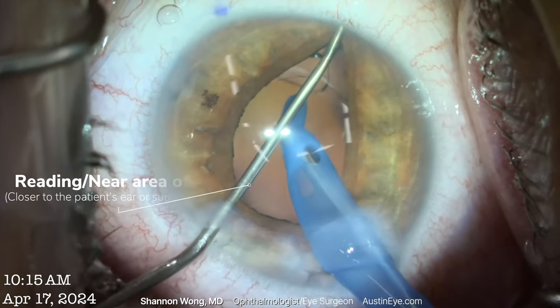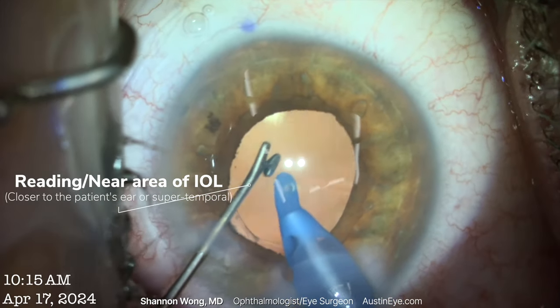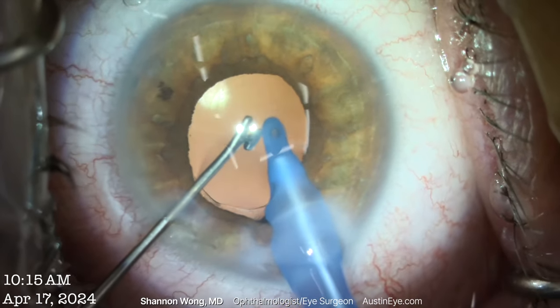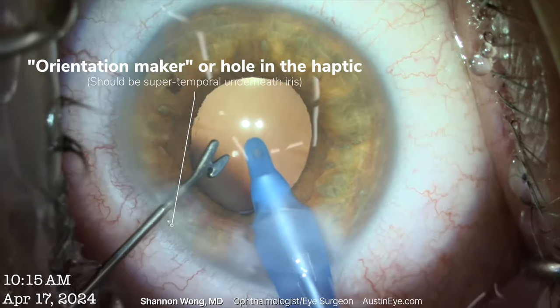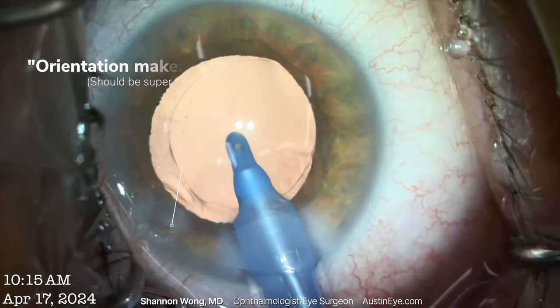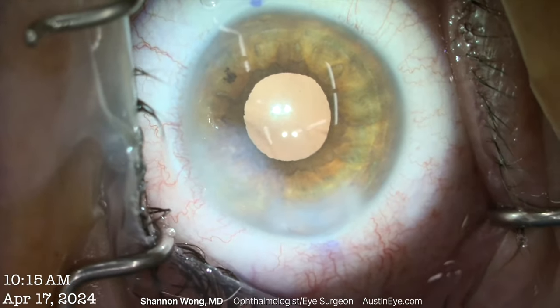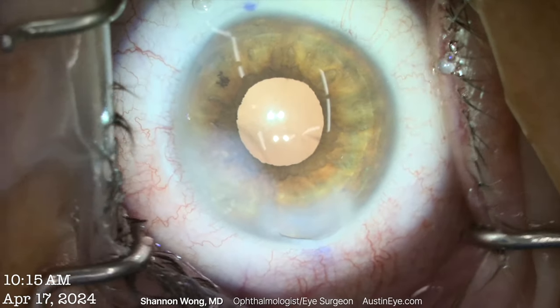Checking the haptic — no notch. The orientation marker should be at bottom left. Pressure's good. Water tight. I think we're done.